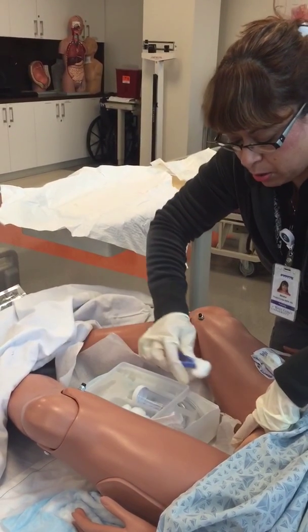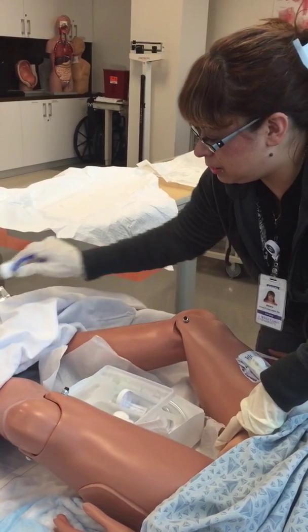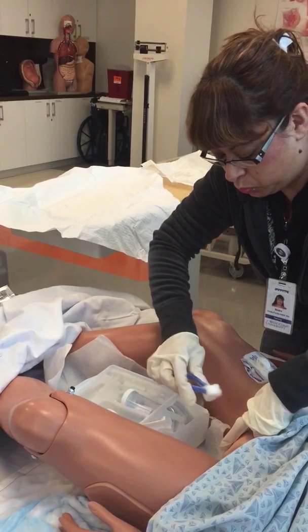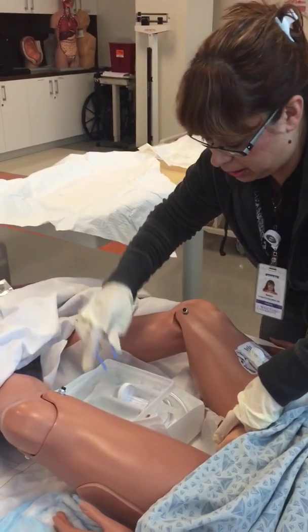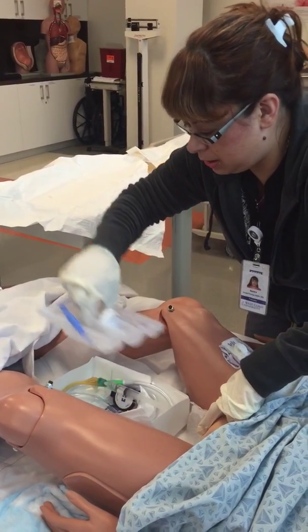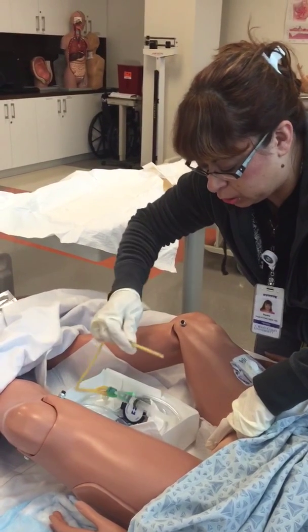So I'm going to clean with downward strokes. Clean, dump, clean, dump, clean, dump, clean. Get rid of that. Okay, I'm done with this. I can even get rid of this whole thing. Now this has already been lubed.